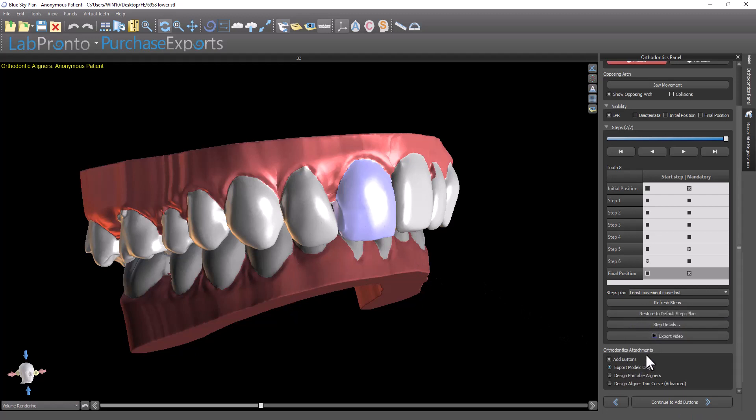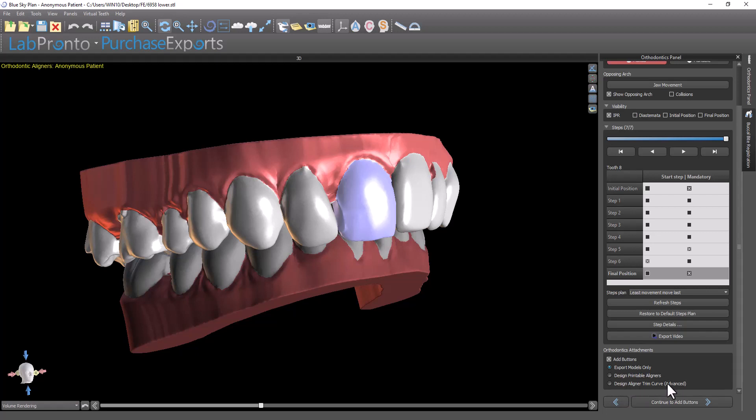I have the checkbox to add buttons and different options for how to continue after adding buttons. I can proceed to export the models, design printable aligners, or design an aligner trim curve for automatic mill trimming. I'm going to select add buttons and then proceed to export models only.